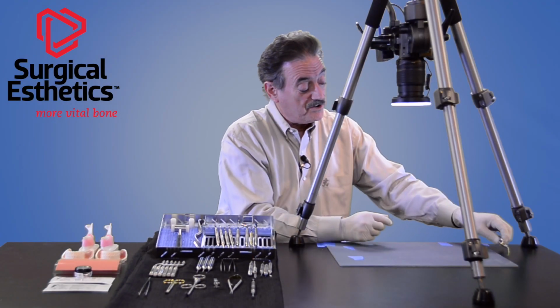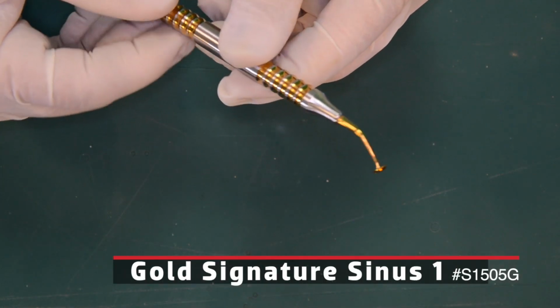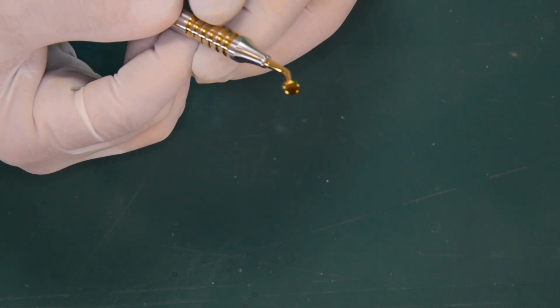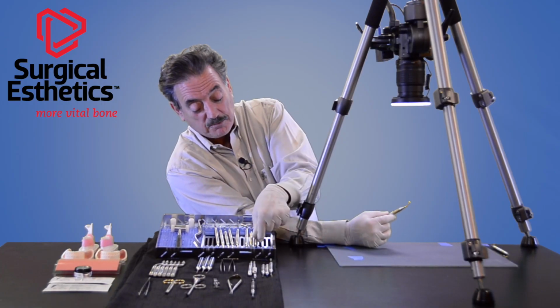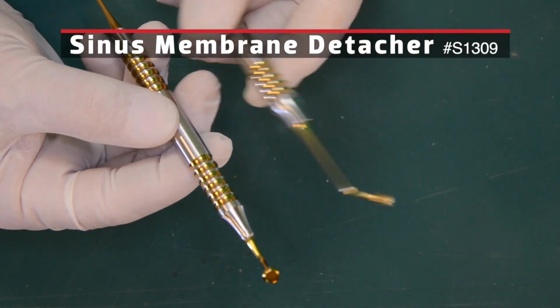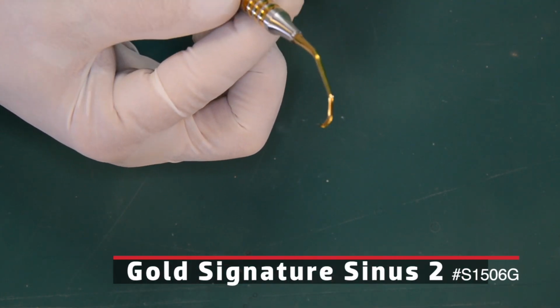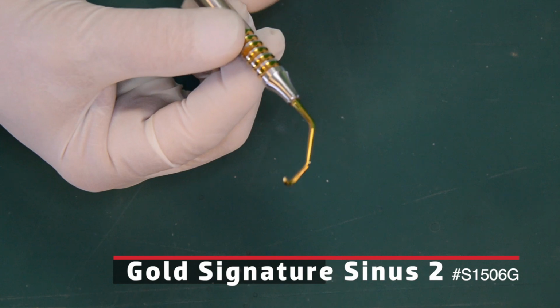The next instruments that are in the kit are actually our sinus lifting instruments, and you can see this has a little mushroom effect to it. And when we're doing potentially an internal sinus lift, this is a really effective instrument to raise that sinus membrane without tearing it. The other instrument that we showed for the bone condensing procedure is also very useful for lifting that sinus membrane. And then once you've lifted the membrane, an instrument like this can go 360 degrees around that opening that you've made to help release the membrane and then be able to pack bone into that area.